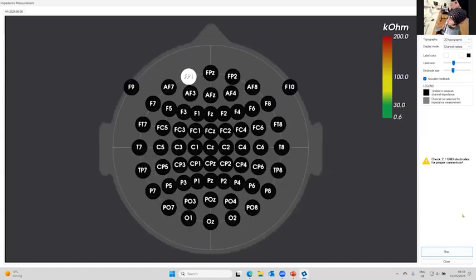Measurement. You can go whatever way you like. I like to go by order. So 4, 5 horizontally, but you can also do the preparation longitudinally. This does not have air here, but it's easy. So it does take some time to measure.